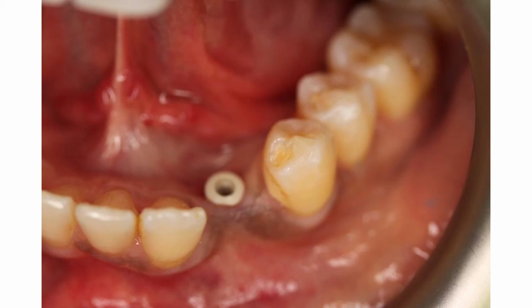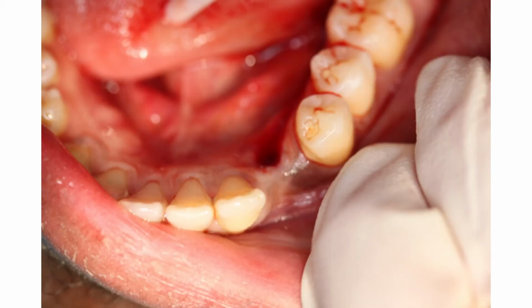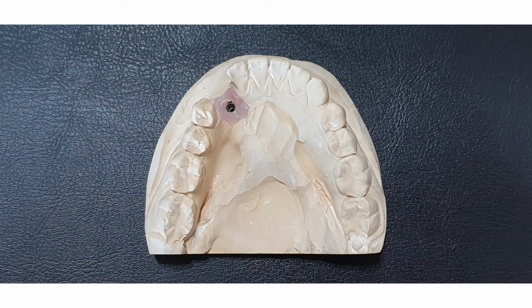They're just instructed to keep the area clean with their toothbrush. There's nothing else. There's no need for any other antibiotics. You may wish to give them one painkiller, but I wouldn't be expecting even too much pain after this procedure, given how small the incision is to actually place the implant. Now, we'll end up with a transfer analog model, and we're now ready to fit this crown.